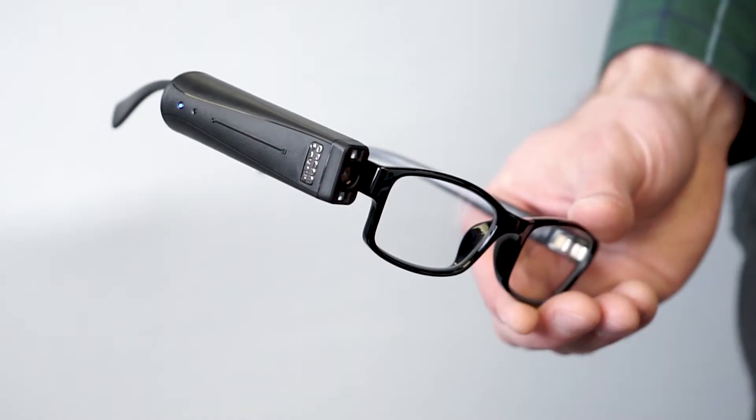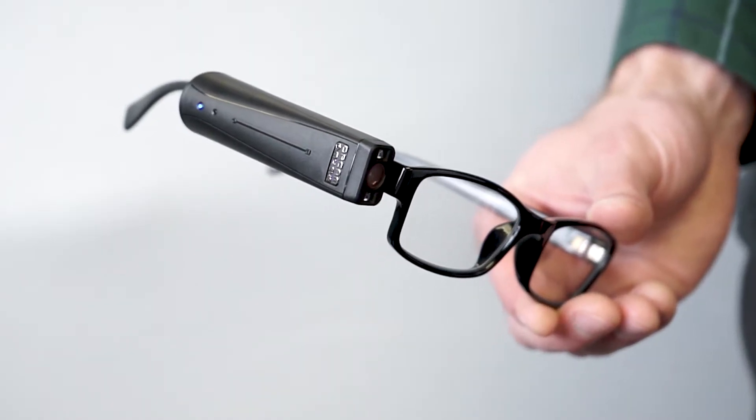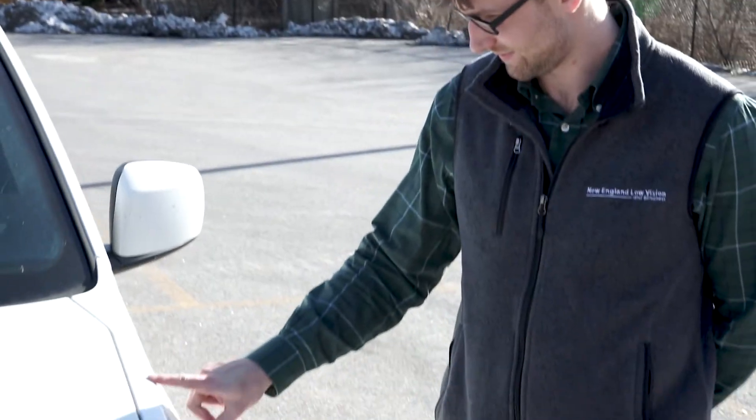Hello everyone, my name is Ben Golash with New England Low Vision and Blindness. Today we're going to be trying out the OrCam MyEye, one of the most advanced low vision assistive technologies on the market, with assistive reading, color recognition, bill note recognition, and a bunch of other amazing features that will help you become more functional and independent.